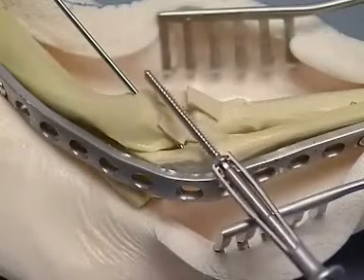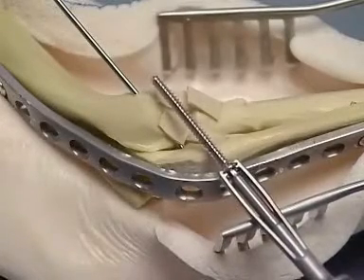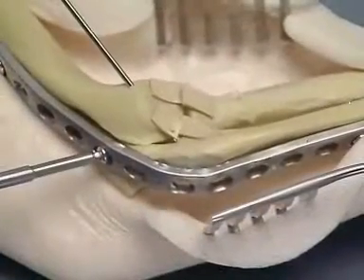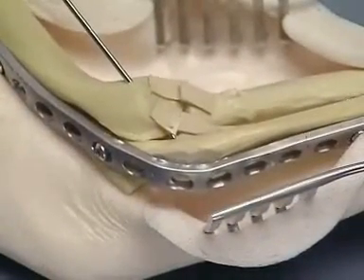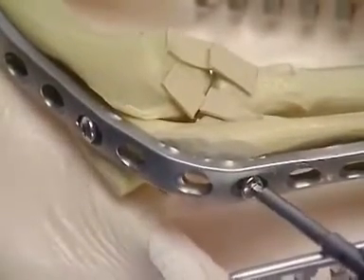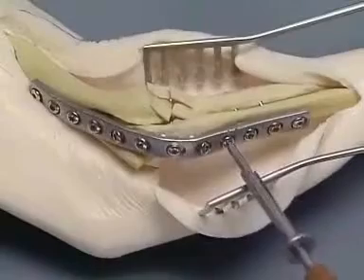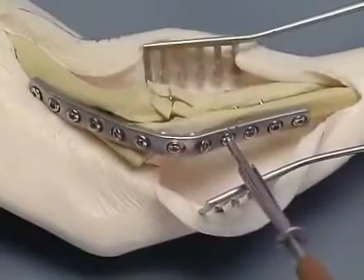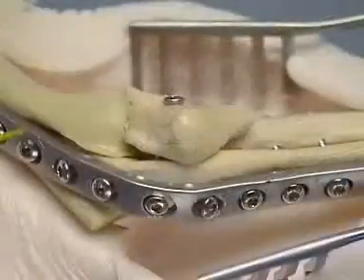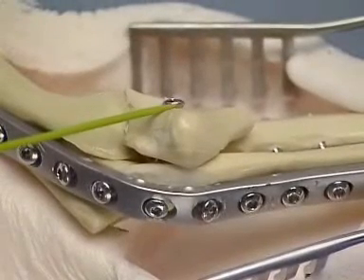A second 3.5 millimeter lag screw is placed through the plate across the ulna and into the medial portion of the humerocondyle. The remaining plate holes are filled. Some of the screws may penetrate the radius. The olecranon is reattached adjacent to the ulna with a 3.5 millimeter lag screw.